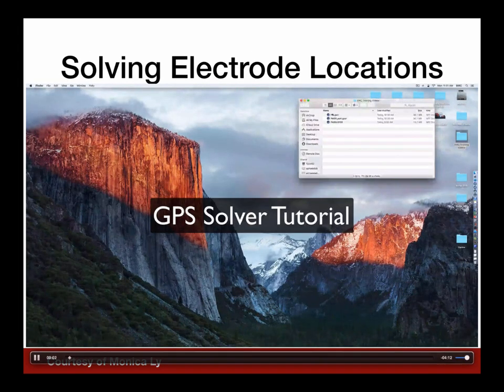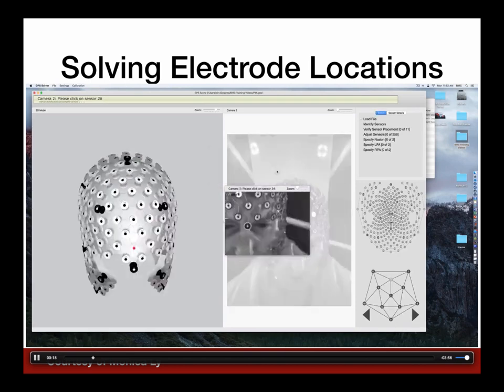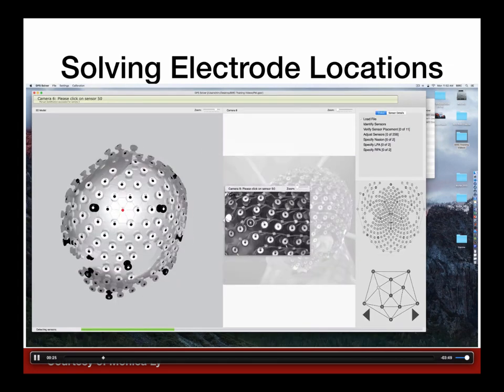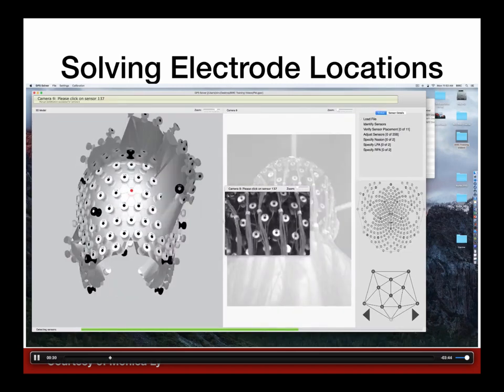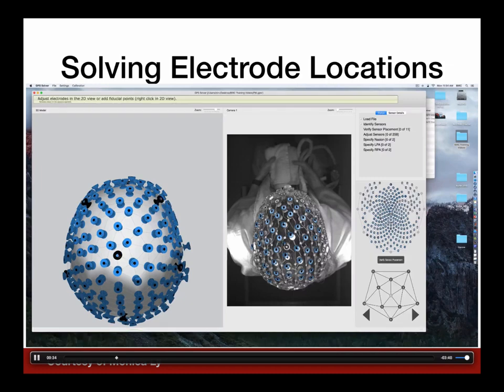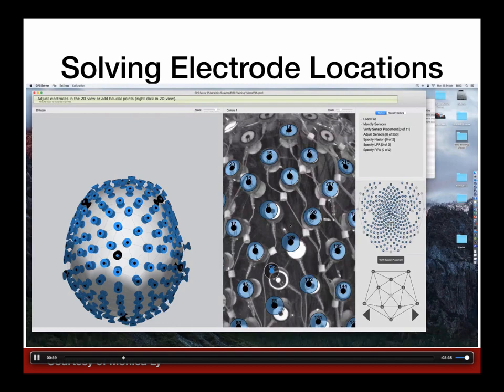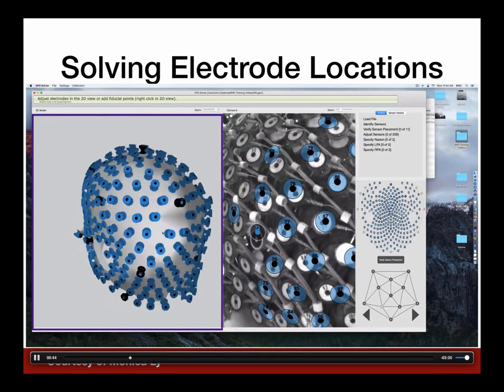I'm going to give you a brief part of this video, in case anyone's curious how this works. Again, I'm trying to balance this between telling you about EEG and telling you about what you could do here. So the first thing we do is we mark a couple of these cardinal locations. This is my former graduate student, Monica, working through very quickly how to do this. Once you mark all of these cardinal points, then you get all of the different EEG sensors, and the software takes a guess at where all of the electrodes are in 3D space.